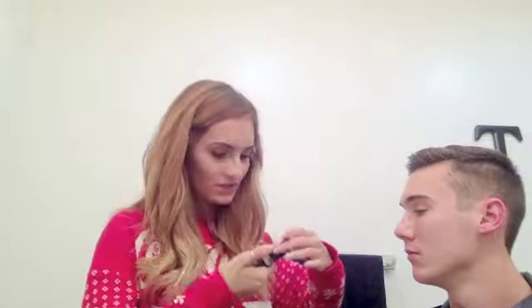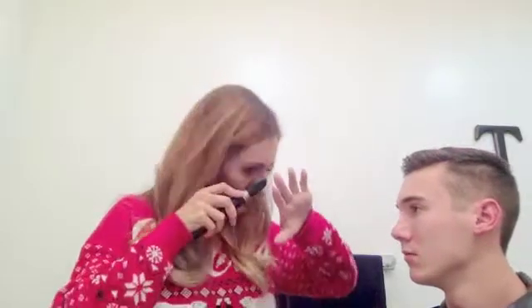And I want to look at his optic disc now. To get a really good view, you've got to get really close to the person. So we're going to use the ophthalmoscope. I'm going to have the light on, and I am going to focus on an object that's near me, and turn the dial until I can see it as clearly as I prefer. It will be different for everyone, so always start at 0.